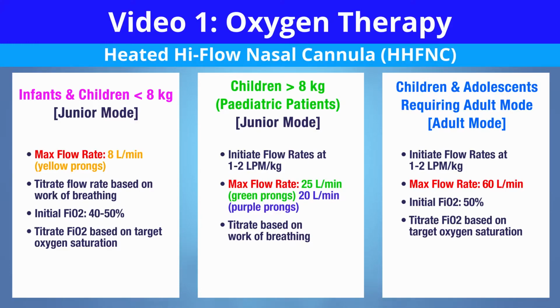Keep in mind the green nasal prongs can only go as high as 25 liters per minute. Your AIRVO device will not allow you to go higher than 25 based off of the prongs and the junior mode settings that are currently on there.